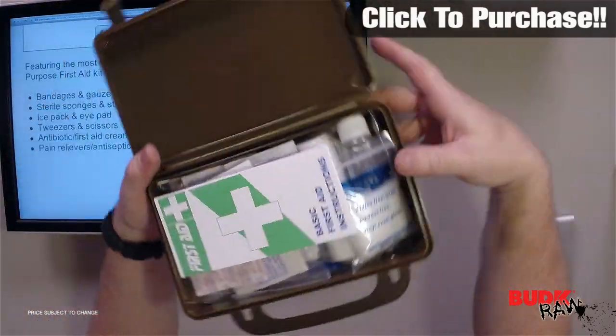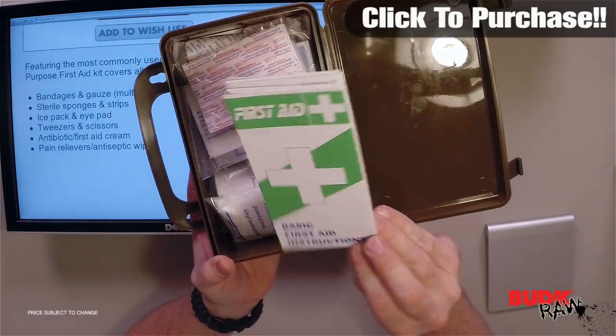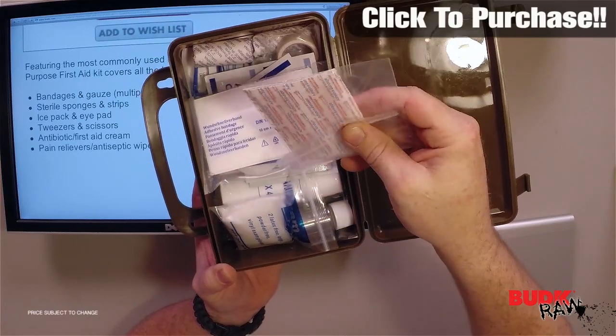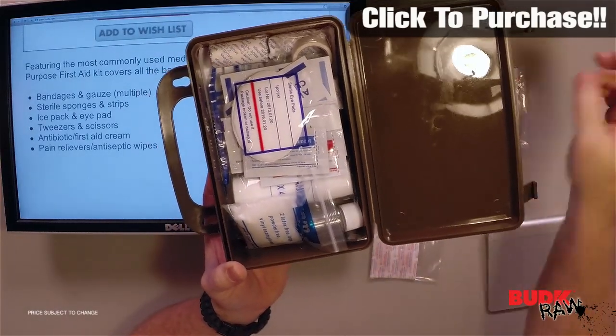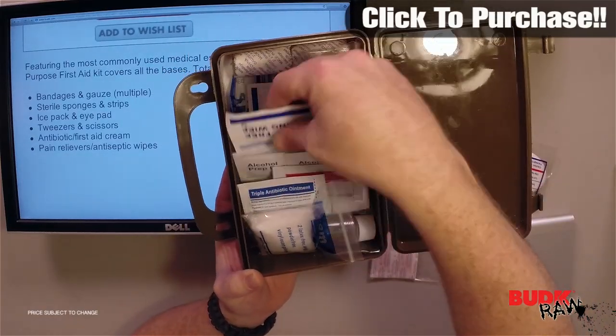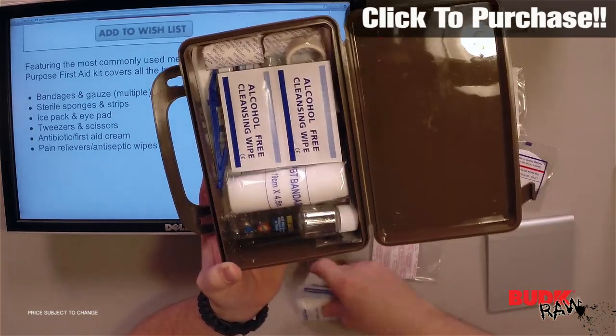Things like bandages and sponges — I'm going to turn around this way. It's got basic first aid instructions, multiple bandages and gauzes, sterile sponges, strips, and all different types of pieces for general first aid. Obviously there are ice packs and alcohol-free cleansing wipes, tweezers and scissors further down.